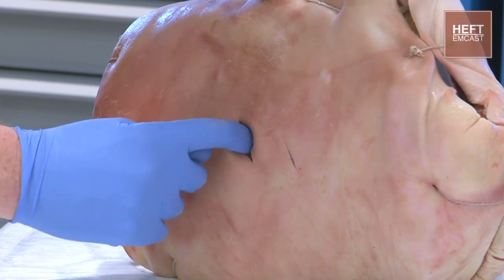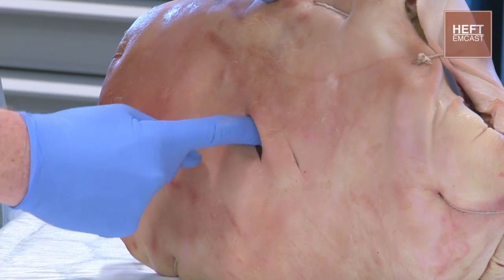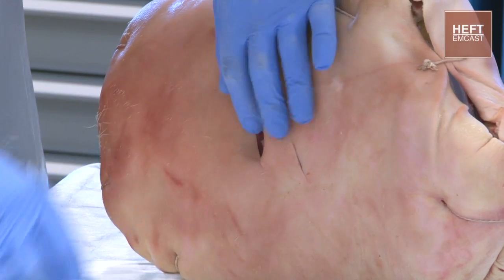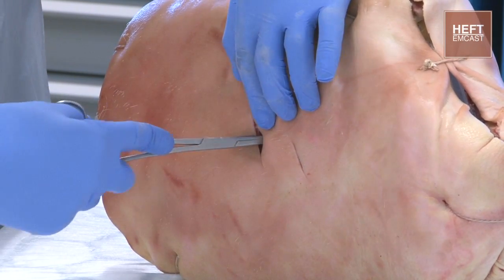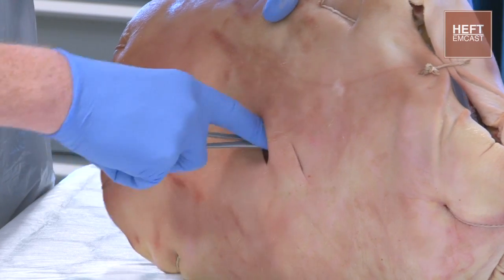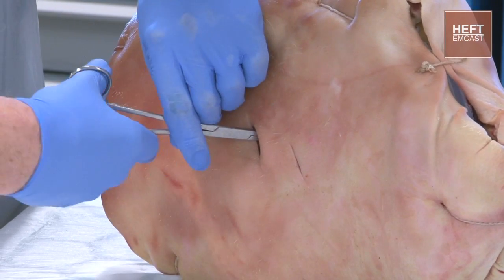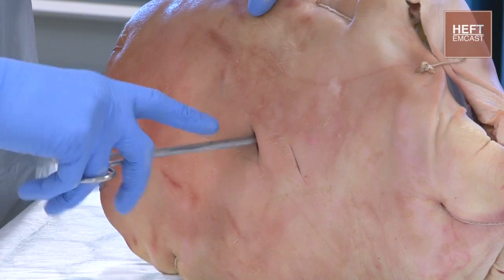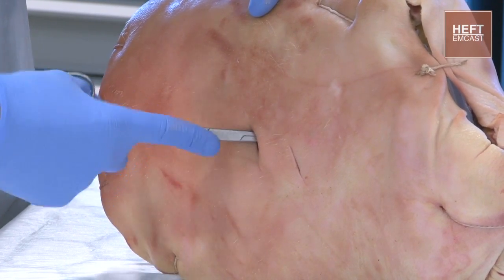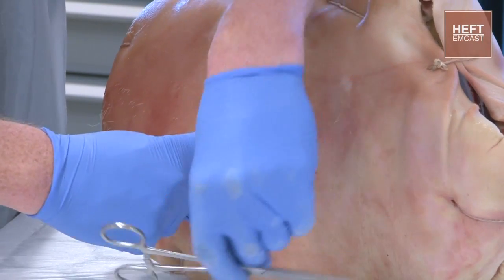We're then going to blunt dissect down between the ribs. Feel for where we are, then get the dissector. Spread out the intercostal muscles and subcutaneous tissue so we're happy we're in the right space. You might also need to get your finger in there to open that up as well.